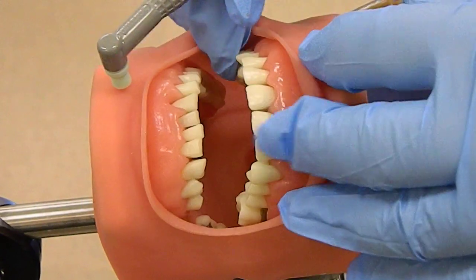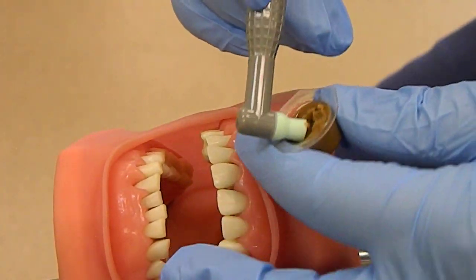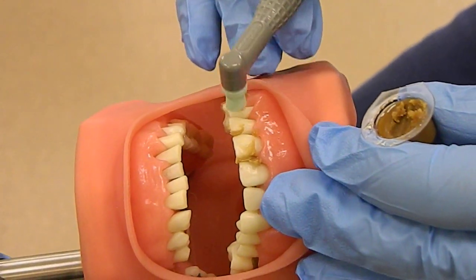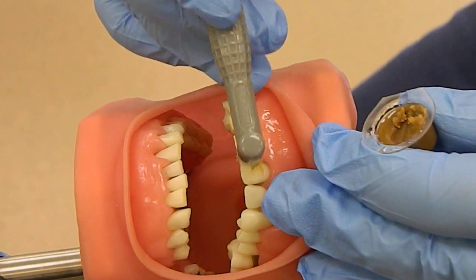Before you start polishing, you want to apply the profi paste. We're going to gather some in the cup and just smear it over three or four teeth, just like that.